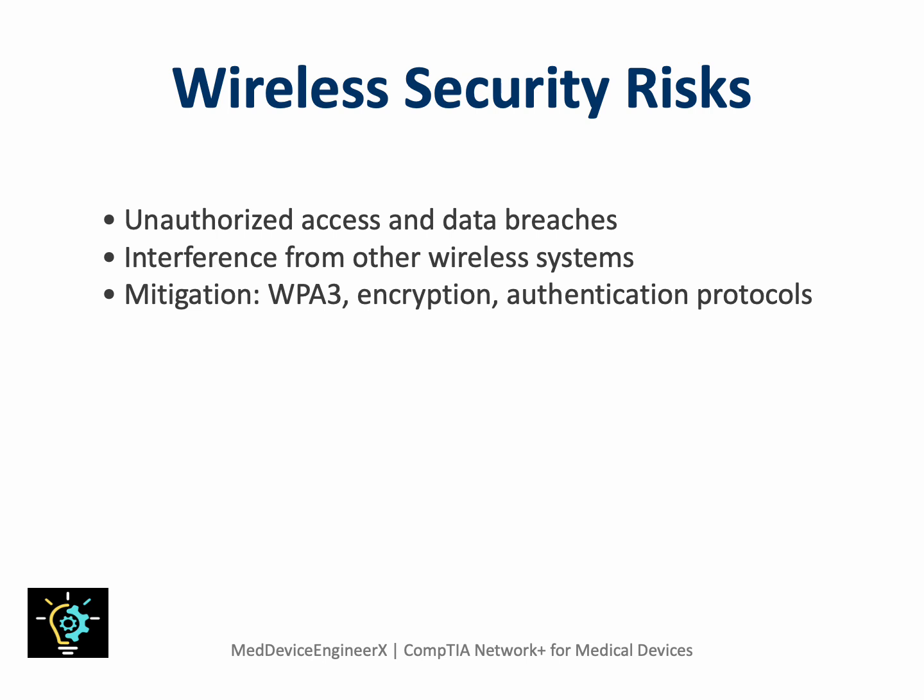Wireless networks introduce unique security challenges in healthcare. Unauthorized access, signal interference, and data theft can compromise patient safety. Common defenses include WPA3 encryption, firewalls, and device authentication protocols like 802.1X. Biomedical engineers play a key role in ensuring devices comply with hospital cybersecurity policies.